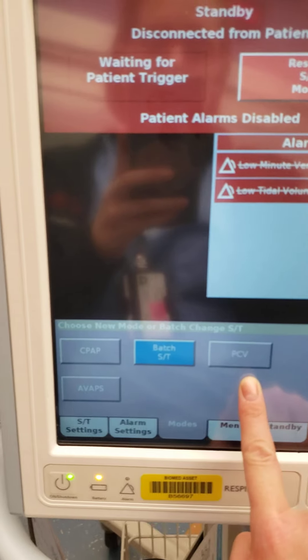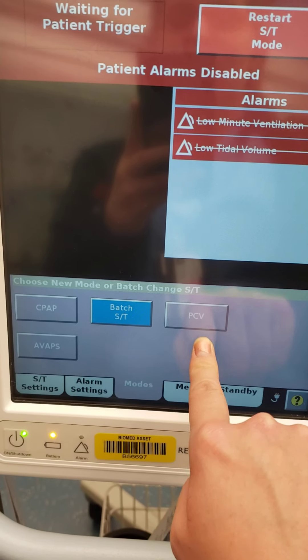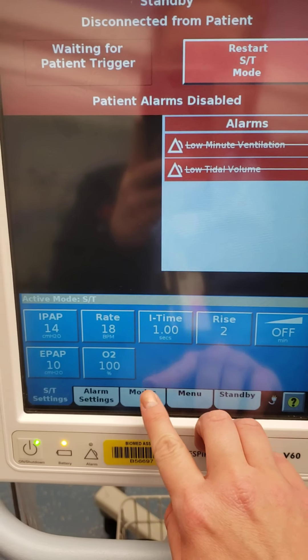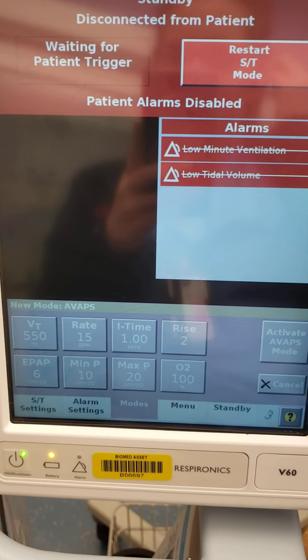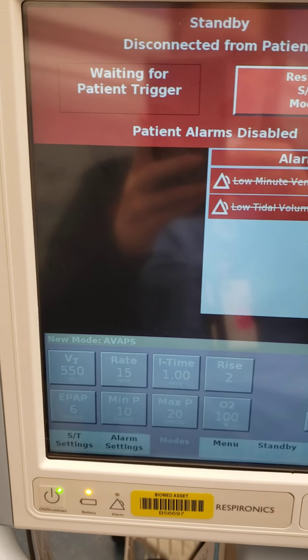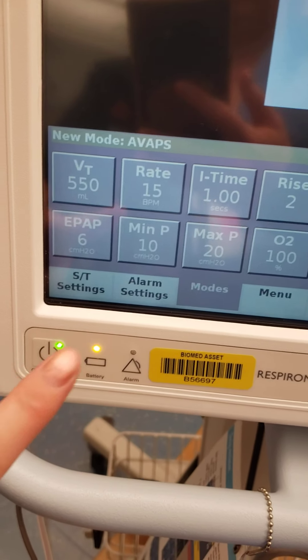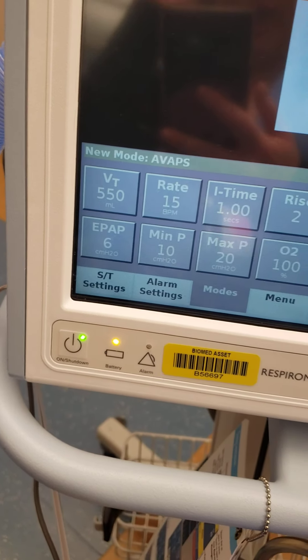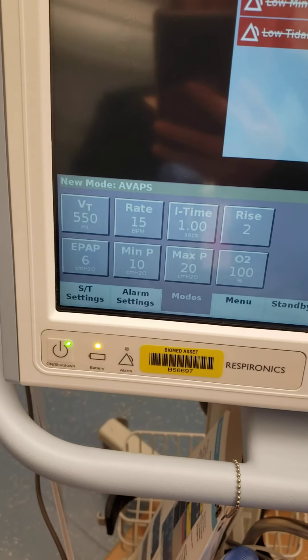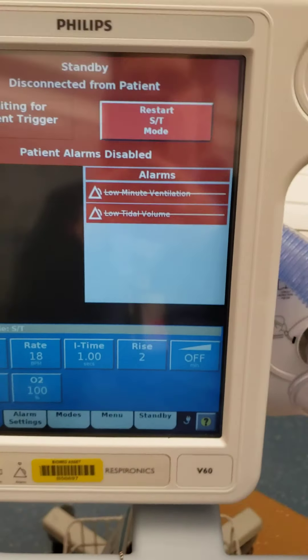PCV is pressure control ventilation. If it's a really bad day in the hospital, this can be used as a ventilator — this is where you would go to run this piece of equipment as you would a ventilator. And then finally is AVAPs, which stands for average volume assured pressure support. The machine is trying to match the tidal volume that you set. We're controlling the pressures because we are a pressure-regulated machine, but your patient can control whatever flow they want. So it can be very comfortable while shooting for a specific tidal volume. It's not commonly used in this area, but it's good to be aware of.